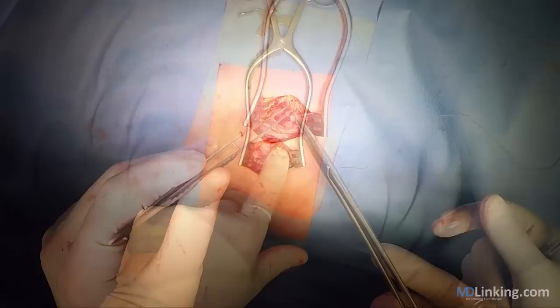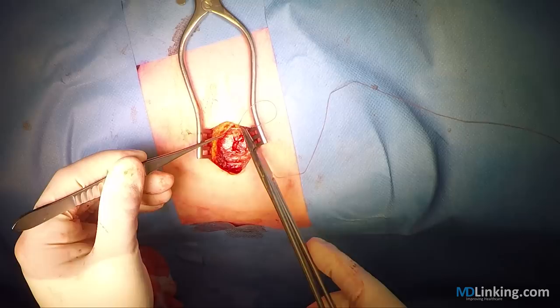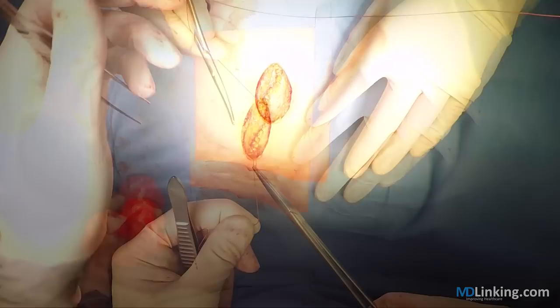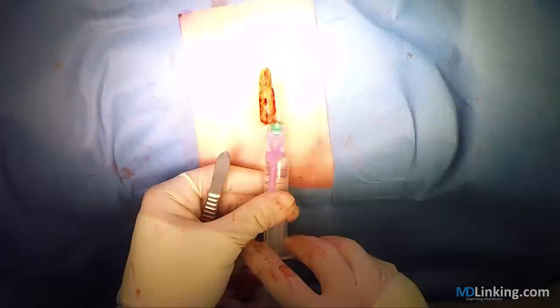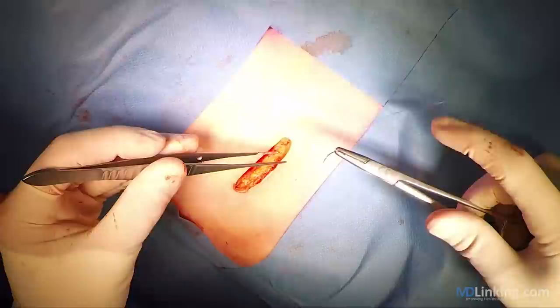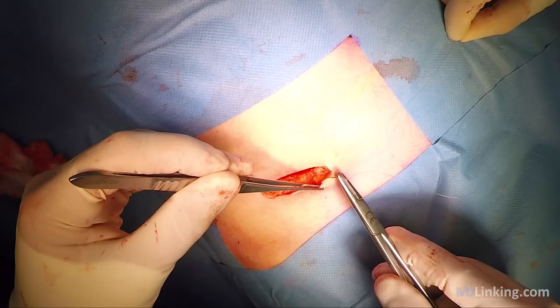We then reposition the cecum back into the abdominal cavity. It's not necessary to close the peritoneum, but it sometimes helps to keep the abdominal content inside while closing all layers. For post-operative pain reduction you can decide to inject the wound with a local anesthesia. We then use an intercutaneous running suture to close the skin.